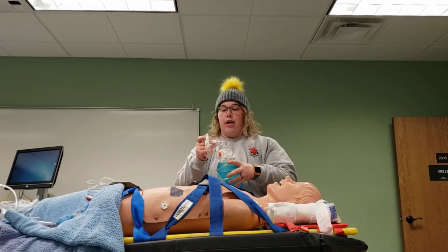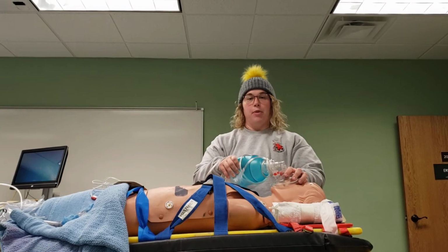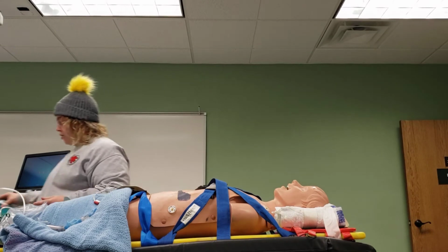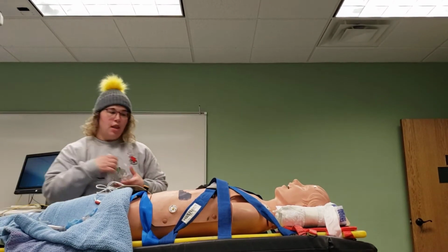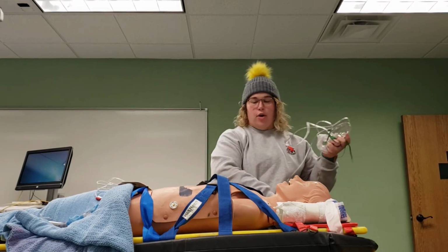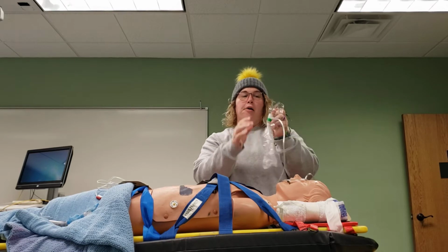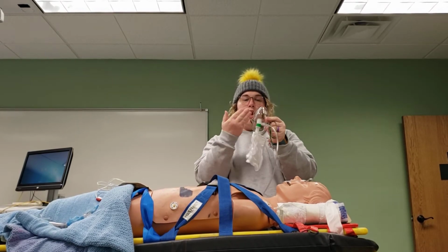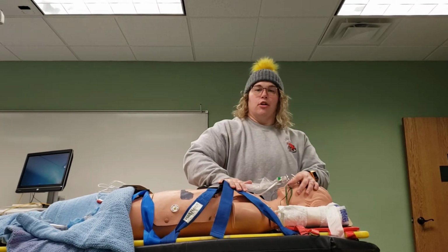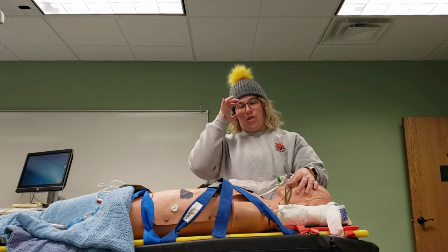So respiratory arrest with a pulse still, we'd be using that BVM, which you'll be able to practice with in future skills labs. The same goes with the oxygen administration equipment. Especially with cardiac arrest now, there have been some studies that show that if you place a non-rebreather, which is the mask with a bag, and there should be holes so that you can breathe in atmospheric air, if you have a non-rebreather on them and you're pushing on their chest, you actually will create some negative pressure to force that oxygen down in there.